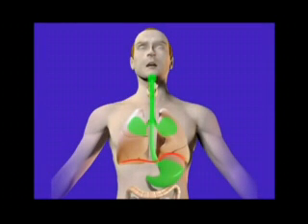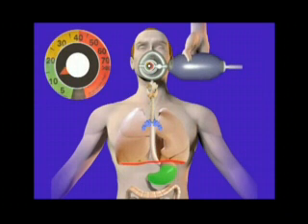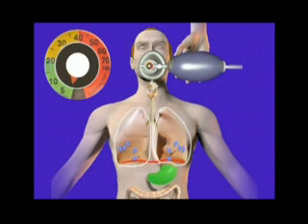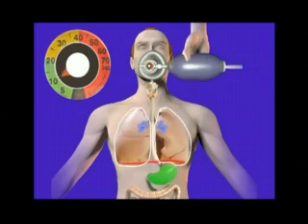Removal of the ITD during CPR to clear vomitus interrupts the negative pressure gradient that has been established. The quality of the CPR effort is compromised while the negative pressure gradient is re-established. Delivering lower inspiratory pressures during CPR with the use of an integrated pressure manometer helps to avoid increasing intrathoracic pressures, gastric insufflation, and subsequent vomiting and aspiration by the patient.